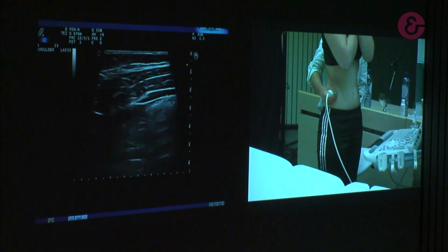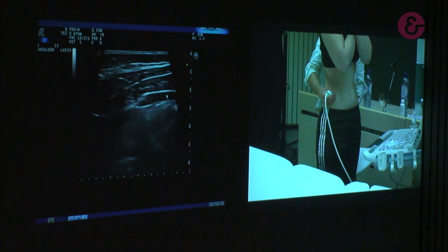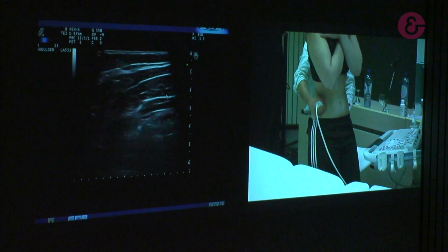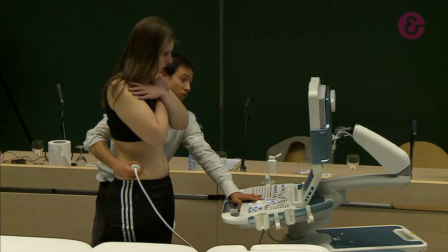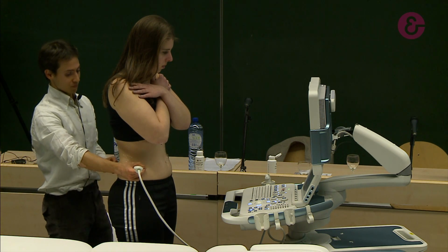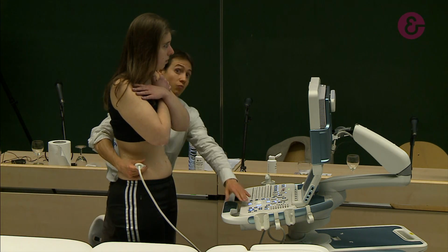So breathe in, breathe out, stop breathing, keep this contraction, and relax. So here it's important to check that transversus abdominis is on. Of course, we have obliquus internus on too because they need to control the movement of the pelvis.